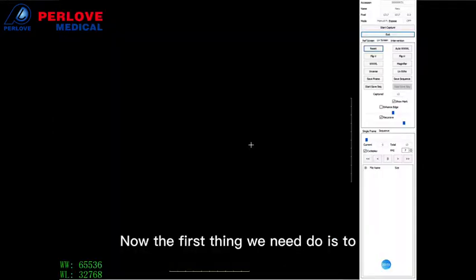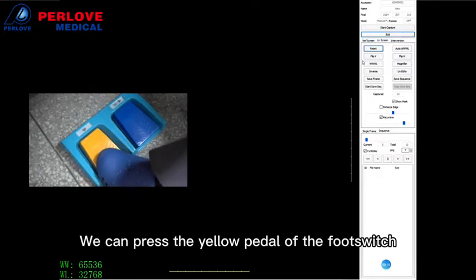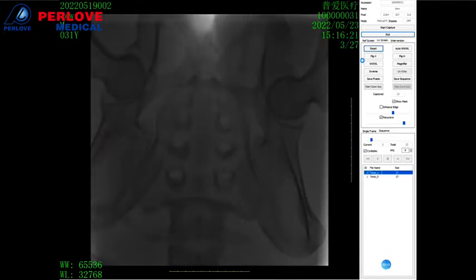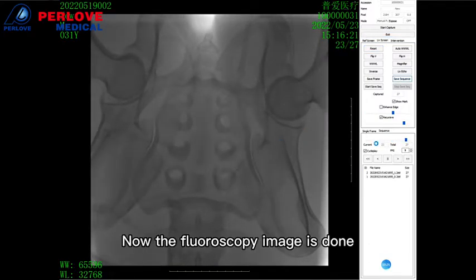Now the first thing we need to do is to take a fluoroscopic image. So we press the yellow paddle of the foot switch. Now the fluoroscopic image is done.